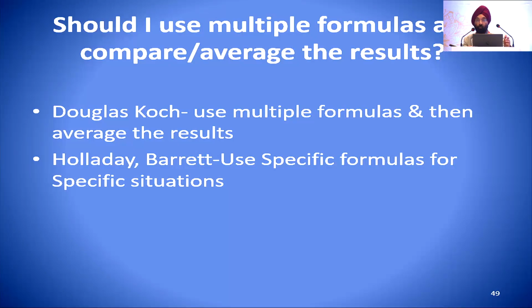So what should I do? Sometimes I get confused. Should I use multiple formulas and average the results? Douglas Koch says, yes, use multiple formulas and then average the results. But Holladay and Barrett say, use specific formulas for specific situations. You don't need to average the formulas.